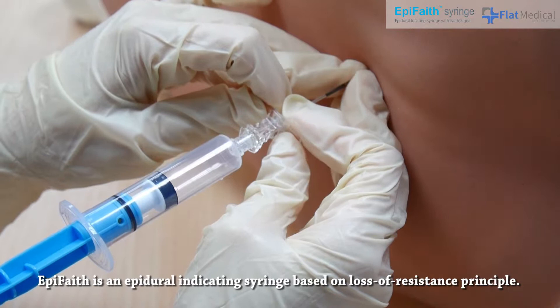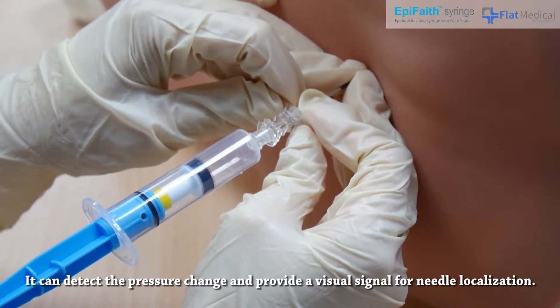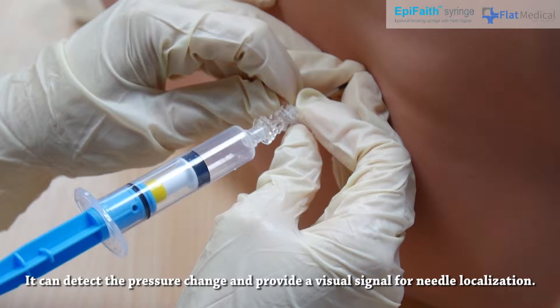AppaFaith is an epidural indicating syringe based on the loss of resistance principle. It can detect pressure change and provide a visual signal for needle localization.